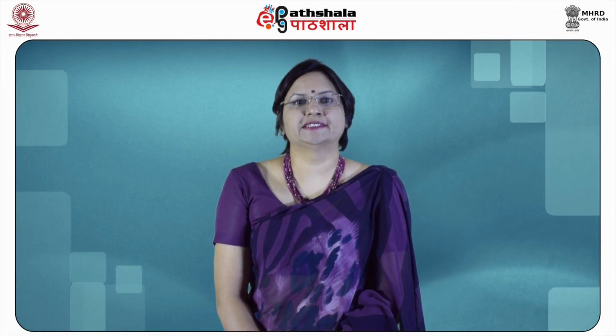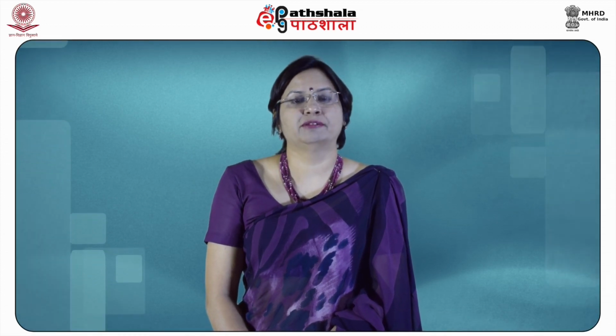So dear students, let us summarize what we have learned in this module. We have learned that a breath analyzer is a device for measuring BAC from a breath sample, and this is much easier to obtain as compared to taking the blood sample or the urine sample of the suspect. Dr. Robert Borkenstein, 1912 to 2002, was the first to design a device that measures a subject's BAC based on the breath sample. So we also had a brief look into the history.